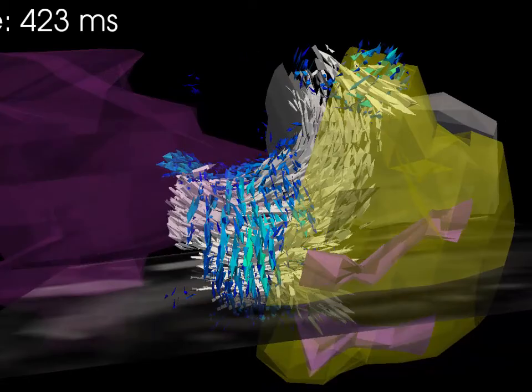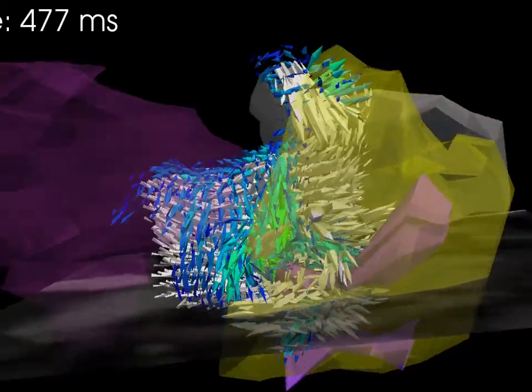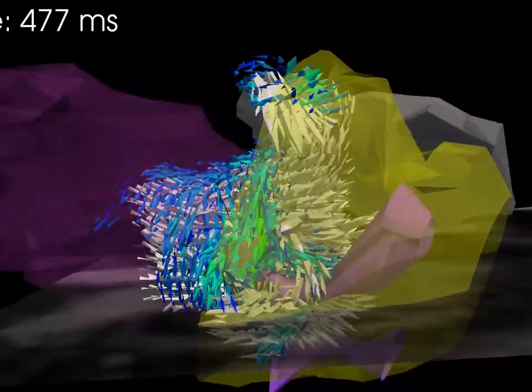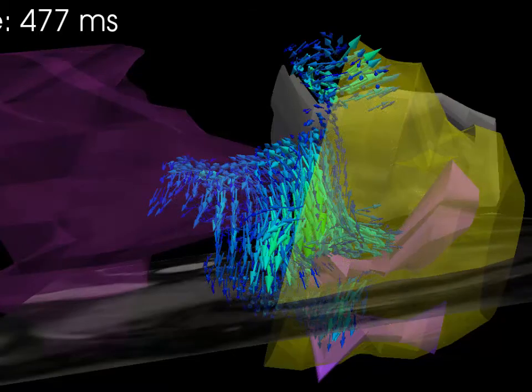This leads us to believe that this vorticity layer is wall bounded on the surface of the tricuspid leaflets, and is probably not part of a freely propagating vortex ring.